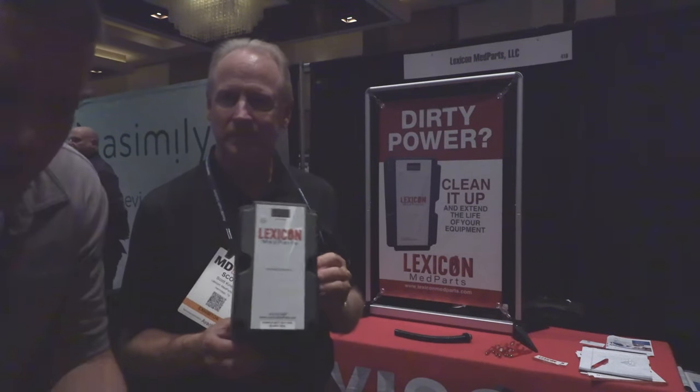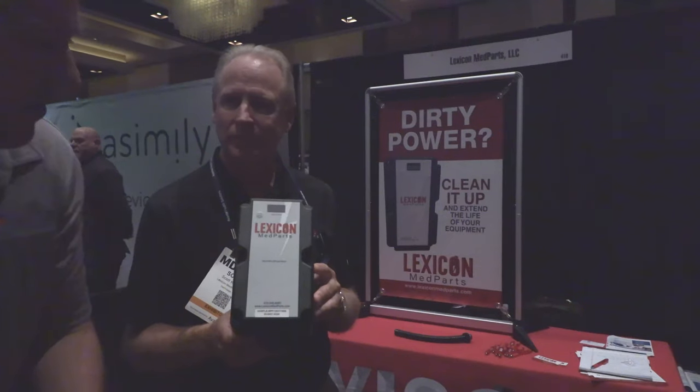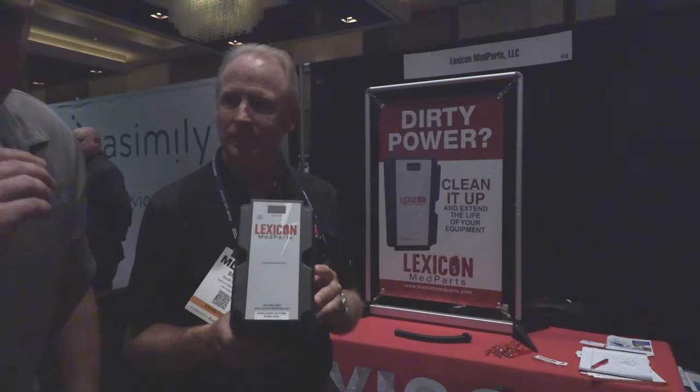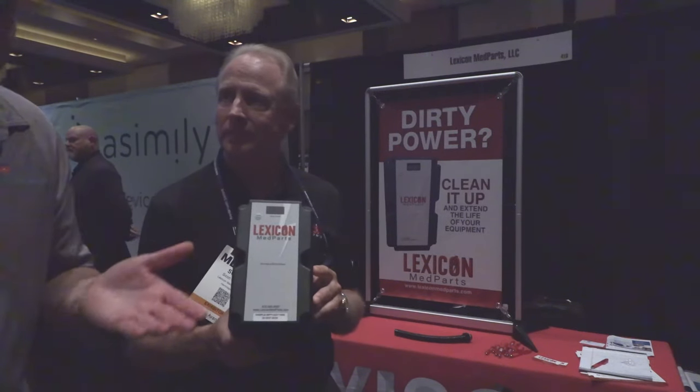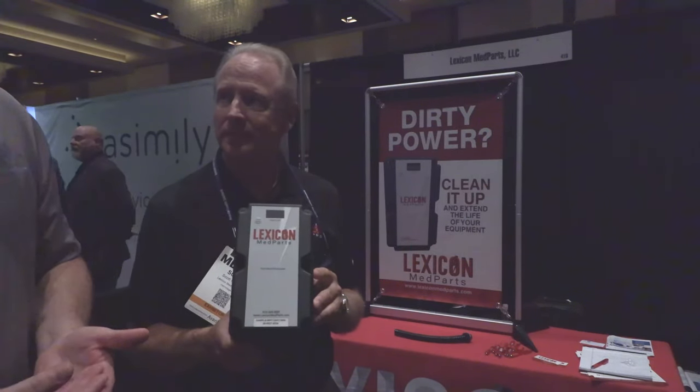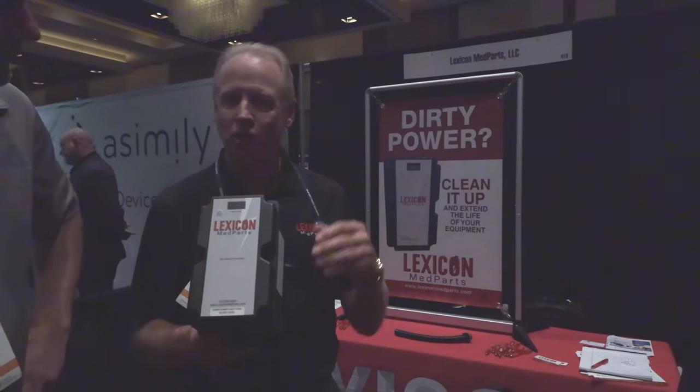Guys, I have had this problem on my medical equipment where I've had to come in and rebuild servers, reboot and restart almost daily on some systems — and it's all because of dirty power. We always knew that, but the thing is in some facilities you really can't do much about it.